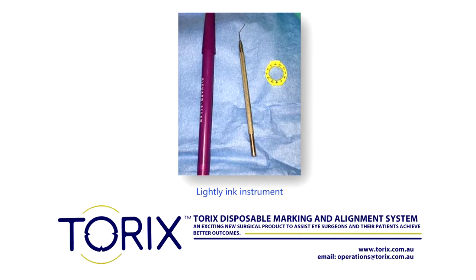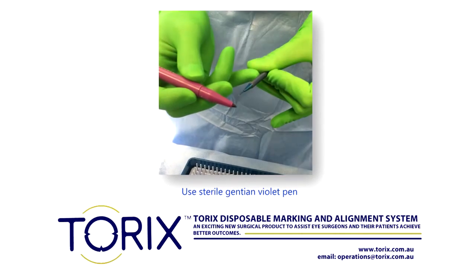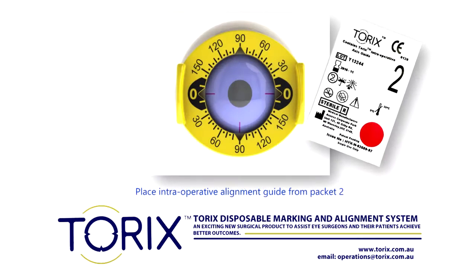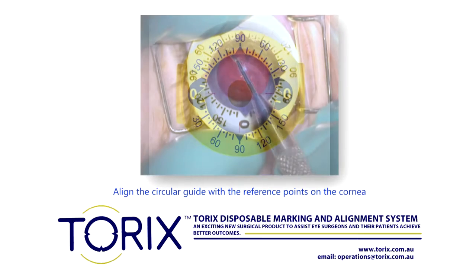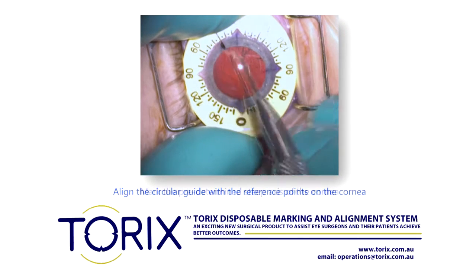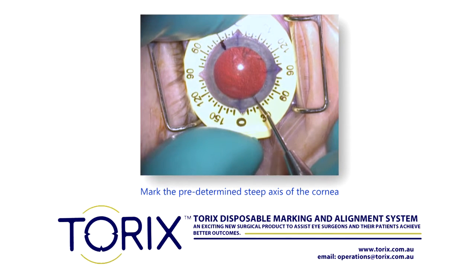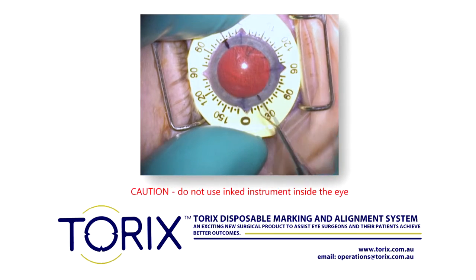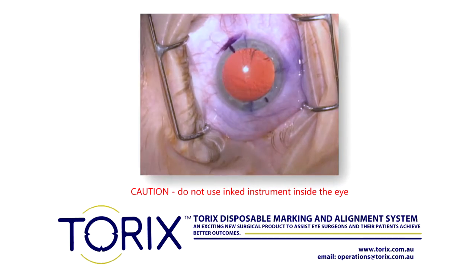At surgery, lightly ink the underside of a Drysdale spatula or similar with a new sterile gentian violet pen. Place the intraoperative alignment guide from the packet marked 2 on the patient's eye, aligning the circular guide with the reference points on the cornea. Then, with the inked Drysdale spatula or similar, mark the predetermined steep axis of the cornea. In this example, it is at 30 degrees, and mark both points 180 degrees apart.